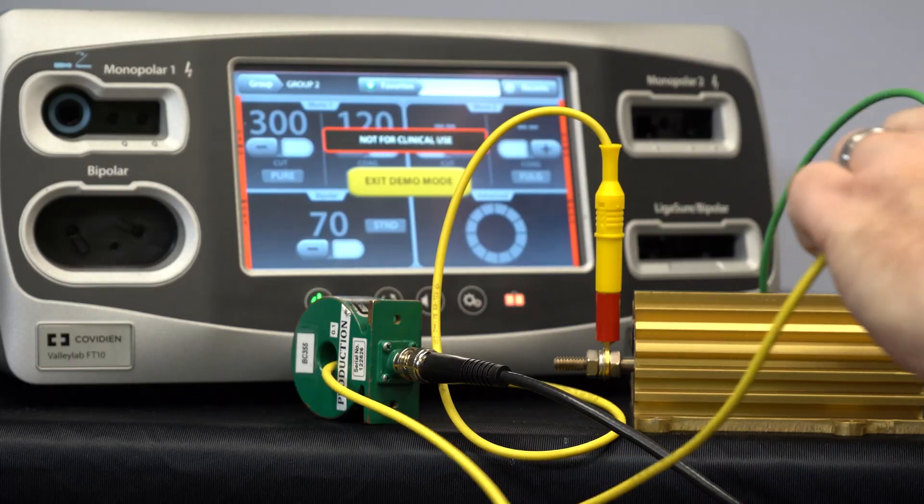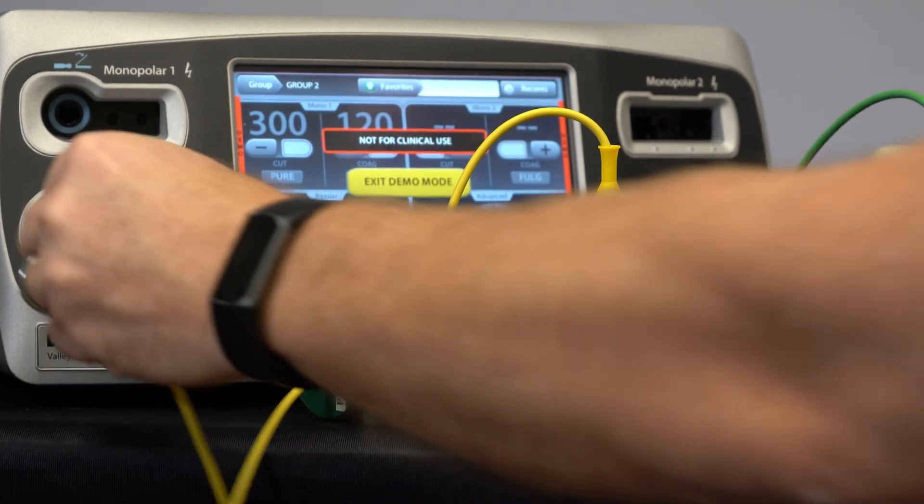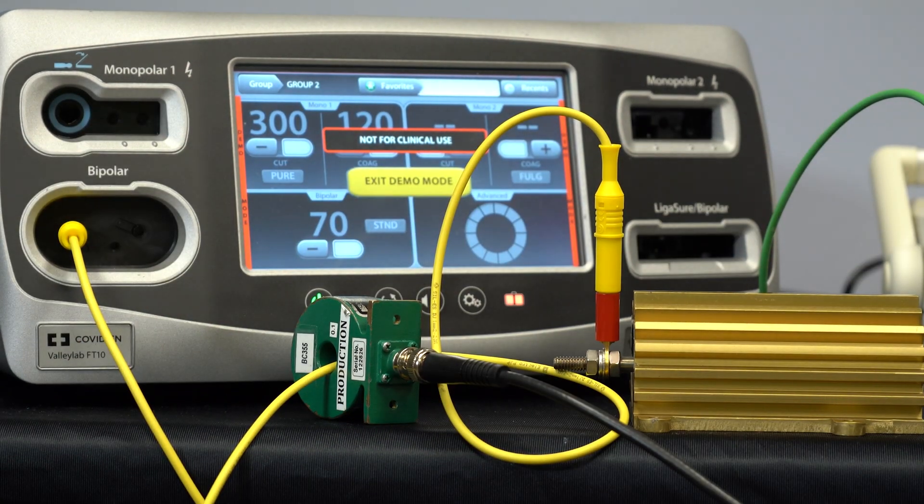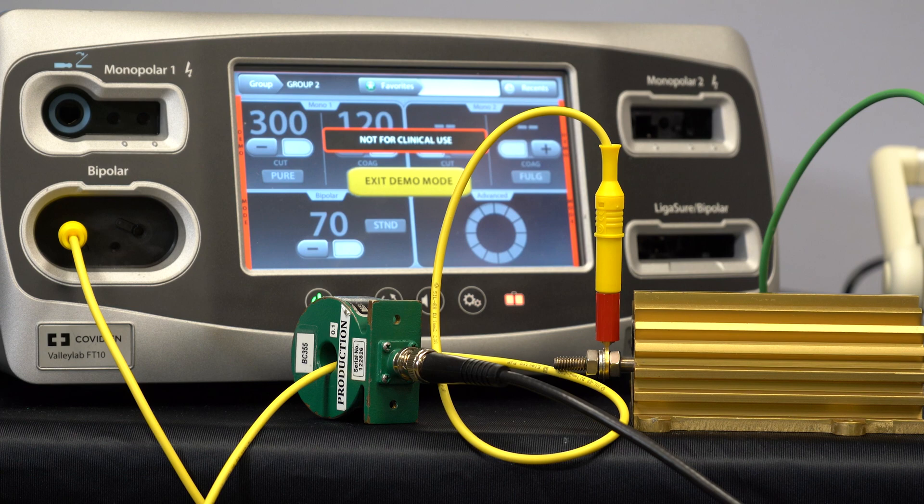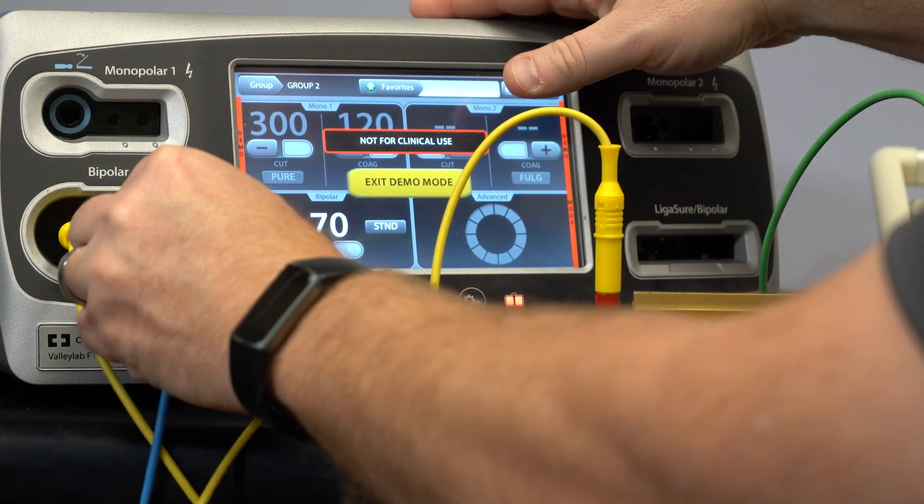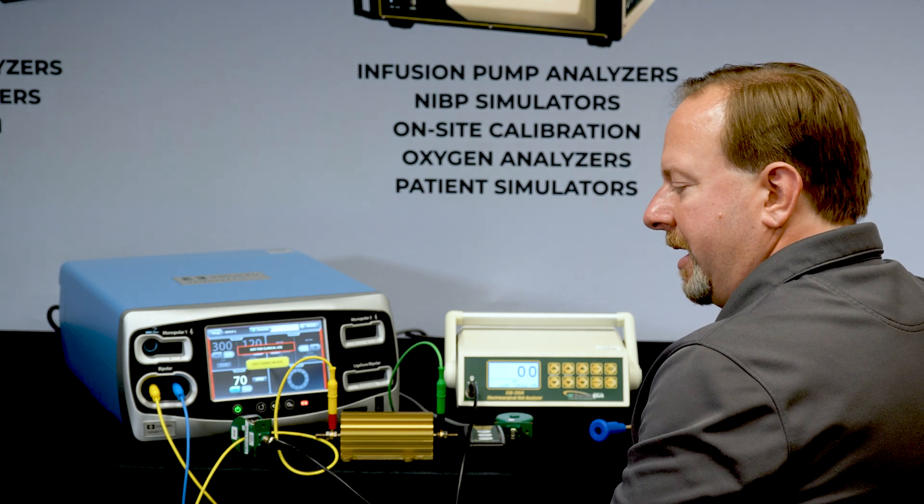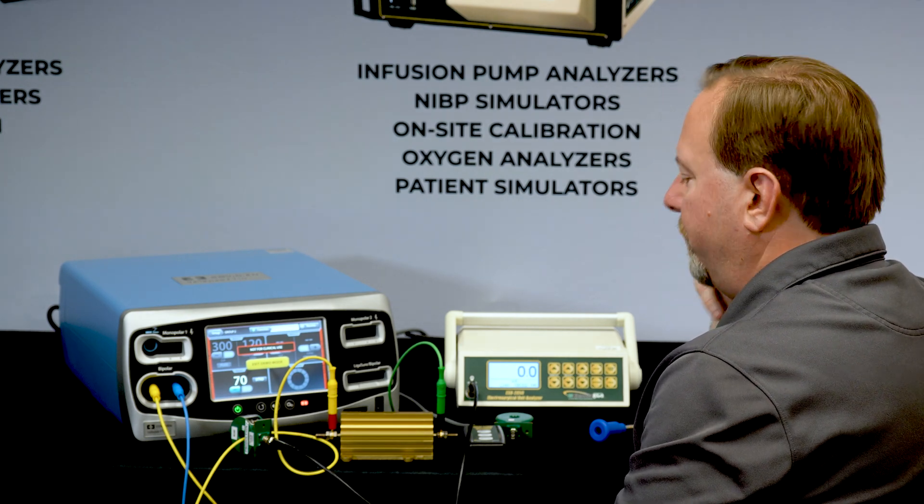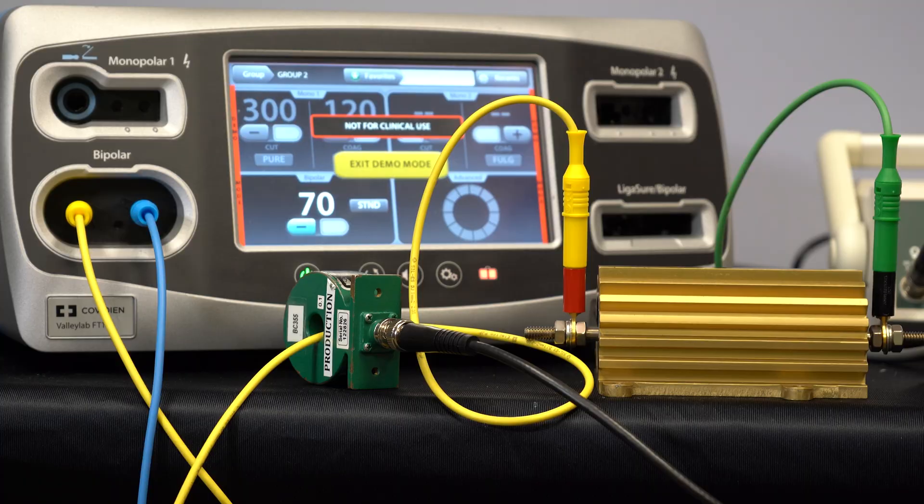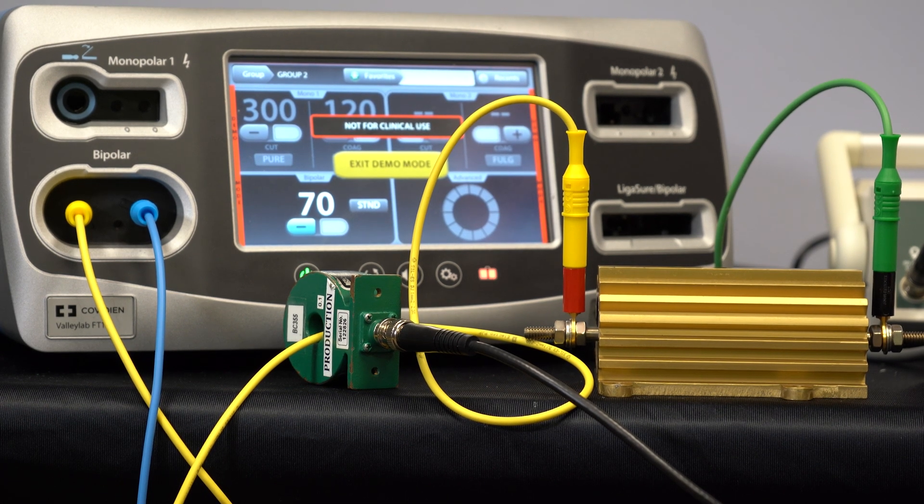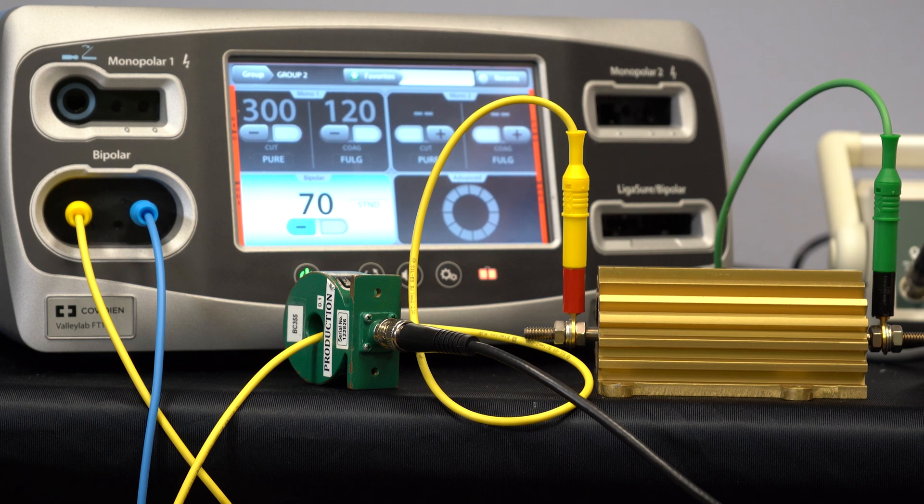We could also test the bipolar. So when we're testing bipolar we have to have both pins of the generator active. There's actually a little micro switch in there that detects whether or not there's a cable plugged in. So if we're going to trigger this with the foot switch port we have to have both of those micro switches depressed.